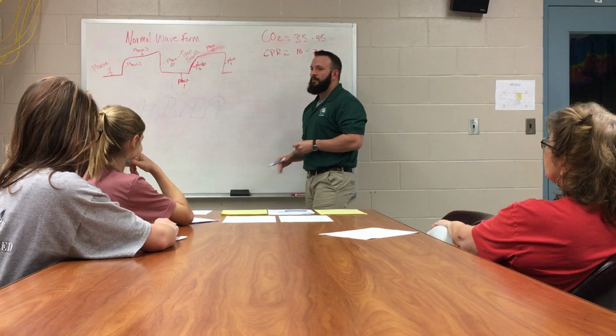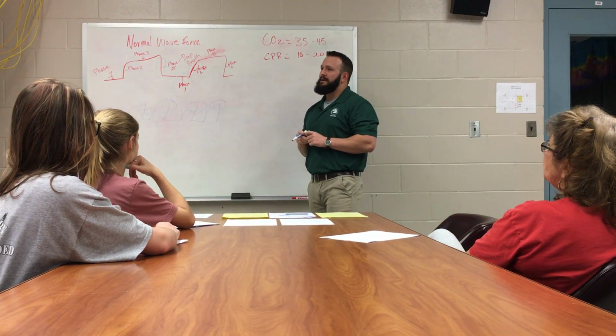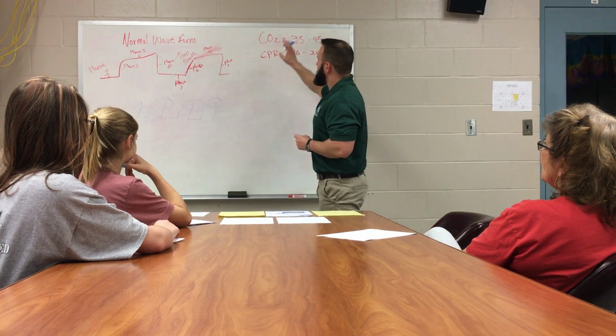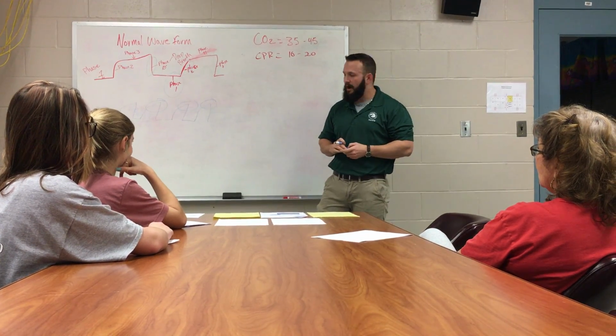So this is one good way that we can really do a quick diagnostic. I put my patient on my nasal cannula, their stats come up, their capnography comes up, and I'll look up there, they're not normal, they have what looks like a shark fin. Well, I can kind of infer that this may be a COPD related problem.